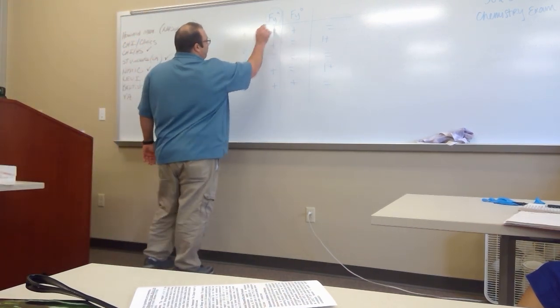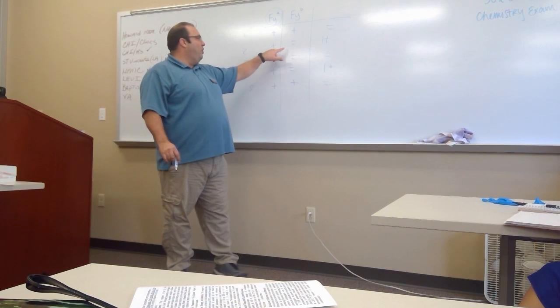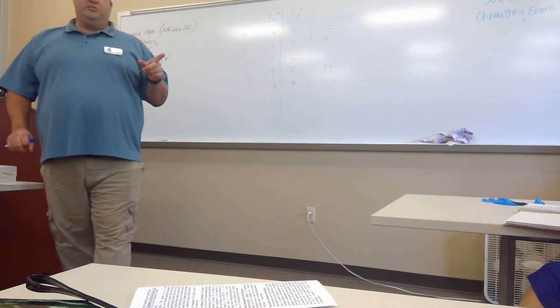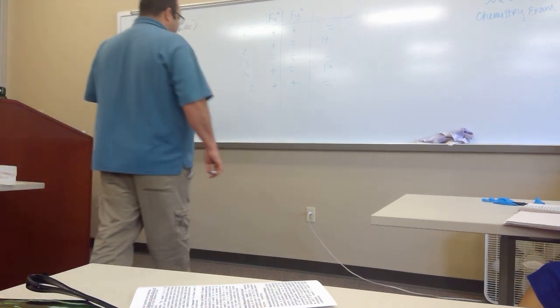Like I said, Duffy A is our culprit, but this one being heterozygous, being weaker, we're not even picking it up, because even the homozygous is pretty weak. And that's what's scary, and I've never had that happen. I've had it show dosage, but never to the point that I couldn't detect the weak one. So it's usually not an issue.